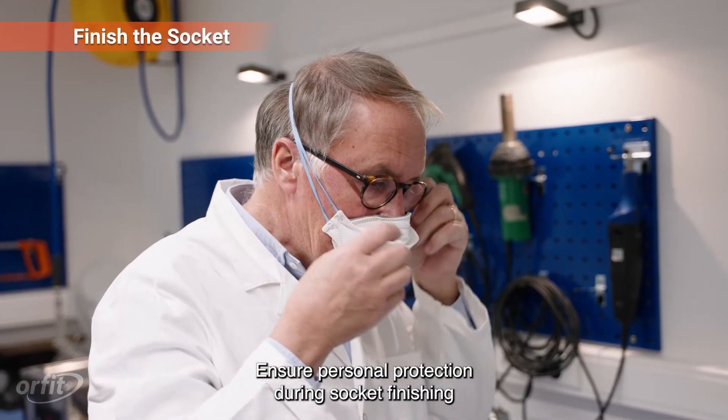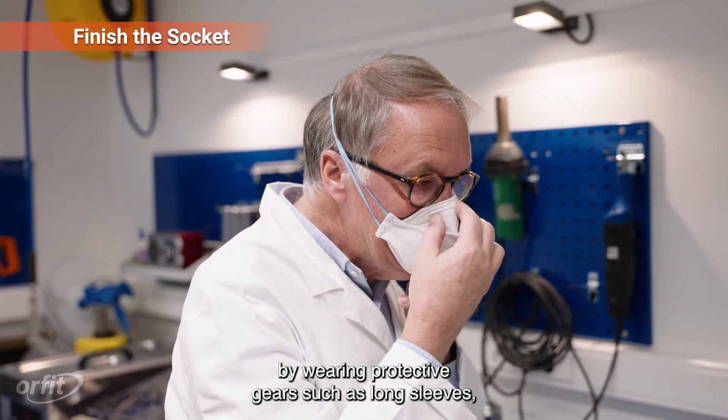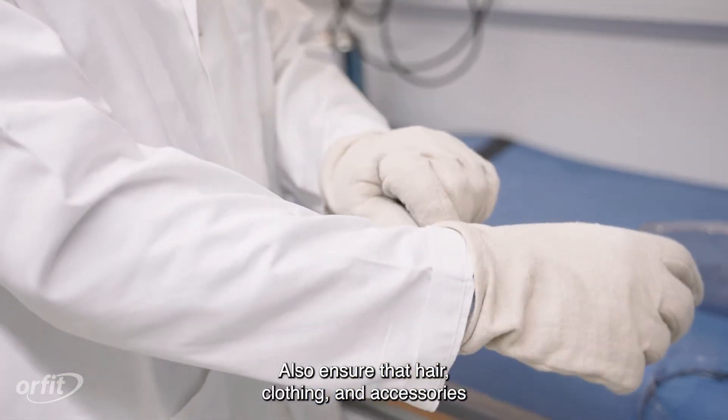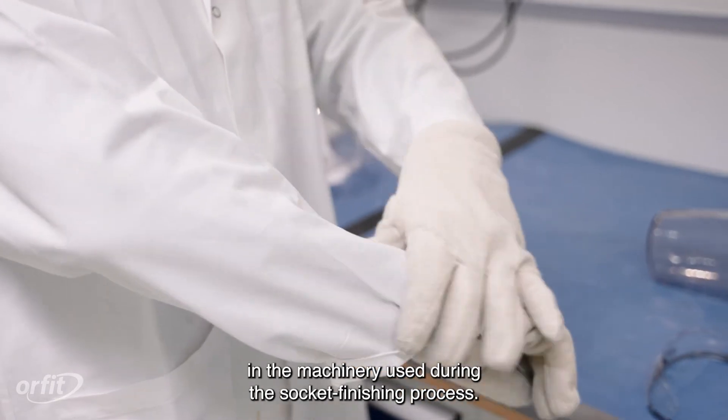Ensure personal protection during socket finishing by wearing protective gear such as long sleeves, eye protection, and a mask. Also ensure that hair, clothing, and accessories are not loose or dangling to be tangled in the machinery used during the socket finishing process.